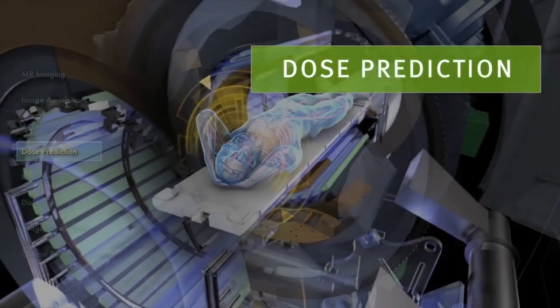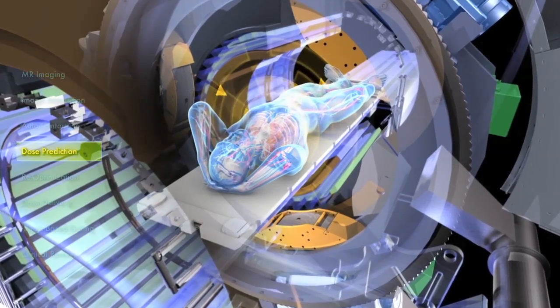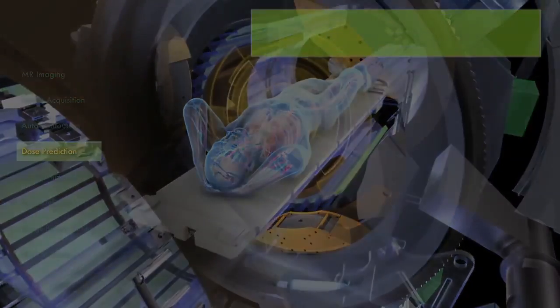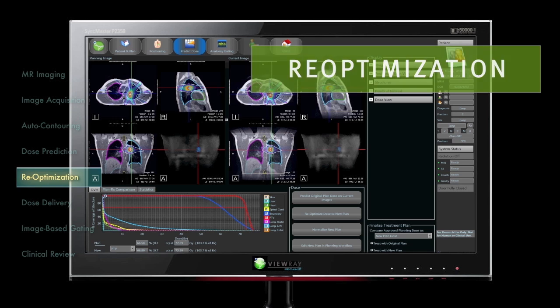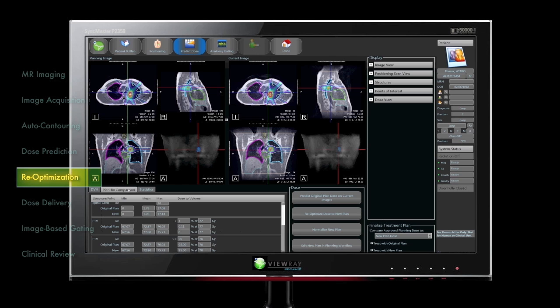On-table dose computation rapidly produces dose distributions and DVHs to predict the anticipated dose delivery. If the anticipated dose is unsatisfactory, the treatment plan is re-optimized using the most recently acquired patient positioning images.